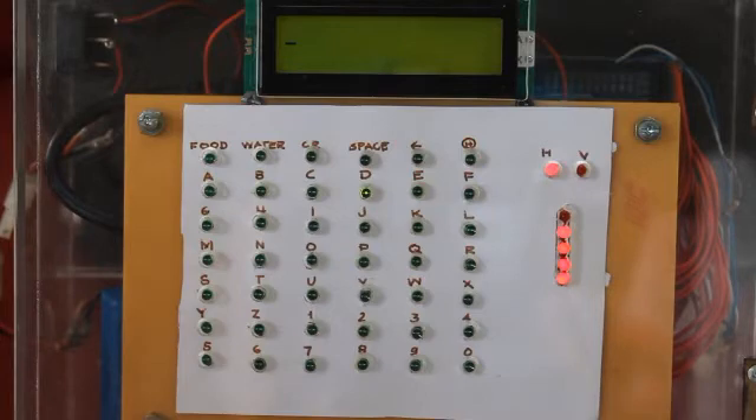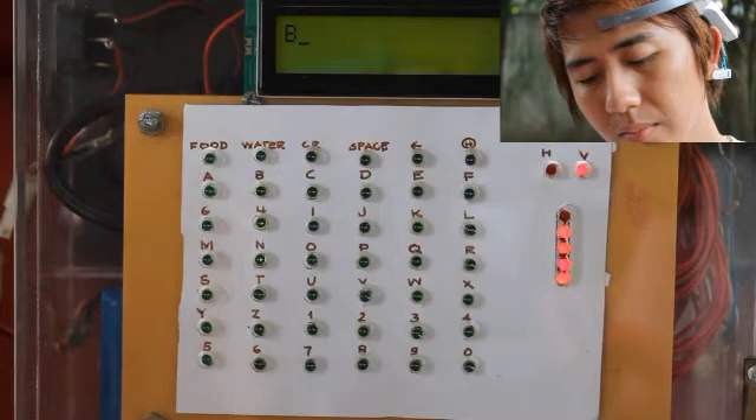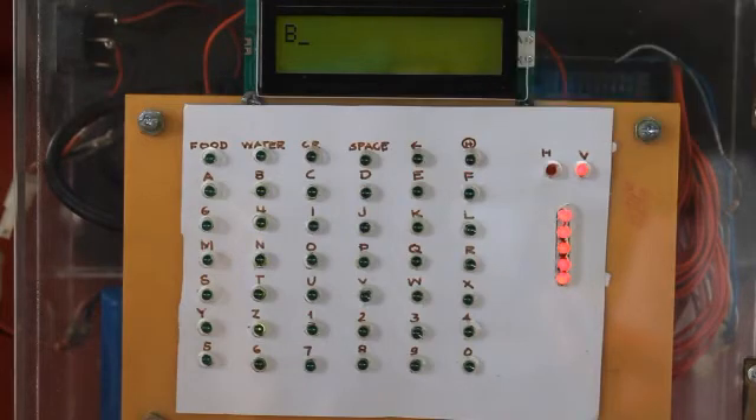How to select a character? Selection is simple. Once the user has navigated the light to the desired character, the next thing to do is to double blink to select the character. The letter or number will then be displayed on the LCD screen indicating that it has been selected. The user continues to do the same process until he forms the desired text.